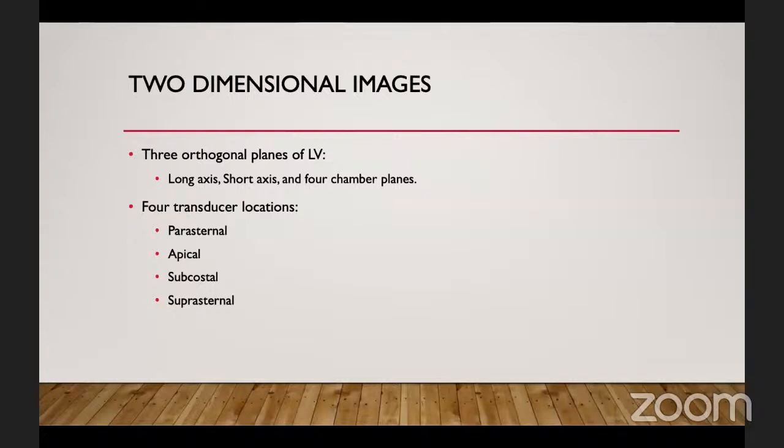Usually we obtain these images from four common transducer locations: the parasternal position, the apical position, the subcostal, or the suprasternal.